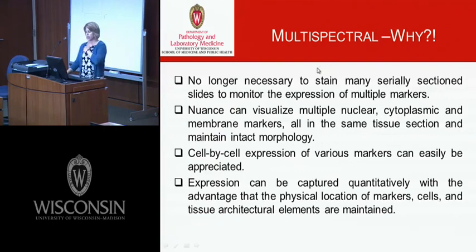So again, multispectral, not multiplexing, but multispectral. Why would you want to do that? As I had indicated previously, investigators used to stain serial sections, one section with one marker, the next section with the next marker, and try and line those up and get a spatial relationship. There's no longer the need to do that.